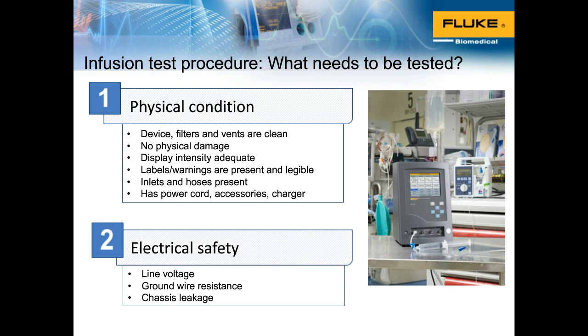That is then followed by electrical safety testing. Electrical safety testing is to ensure that there is absolutely no risk to the patient in terms of leakage current, and that the device is electrically sound. As you know, with patients, the immunity is usually lower, so they are more susceptible to currents that a normal person can maybe absorb. Because of that high sensitivity, there are electrical safety standards, depending upon which country you're testing in, that ensure you are taking those measurements and making sure that your medical device is sound. That also applies to infusion pumps.